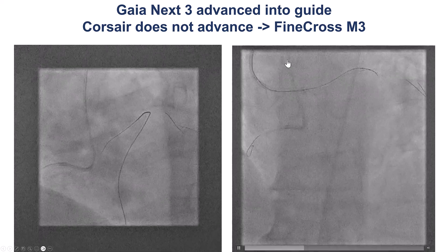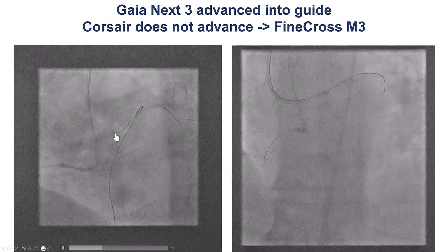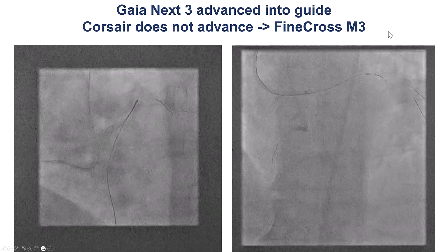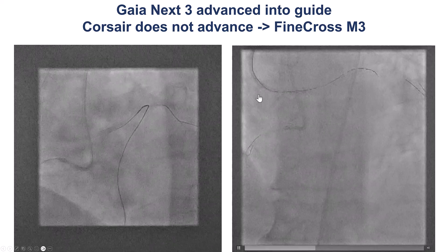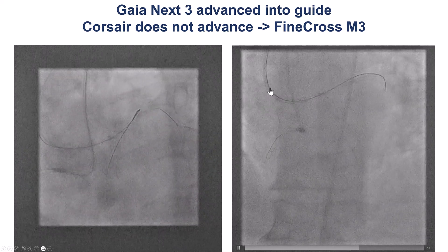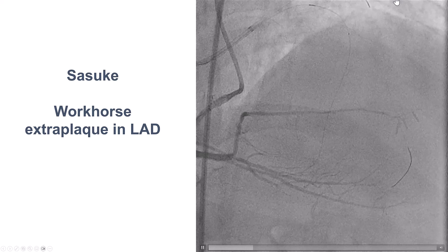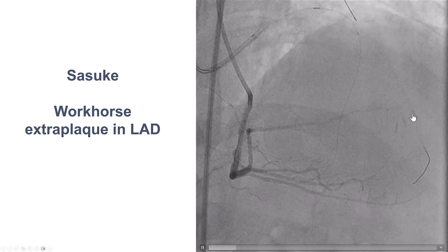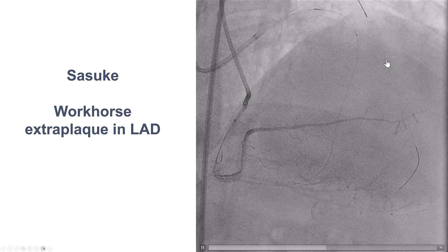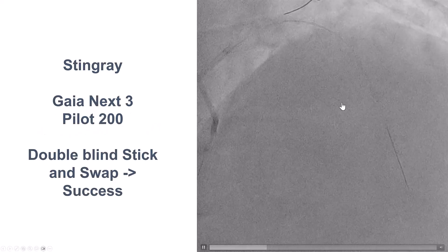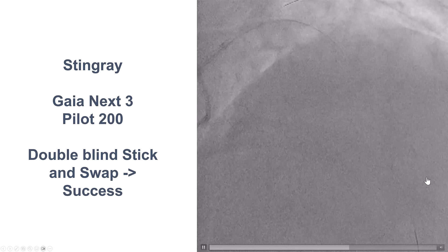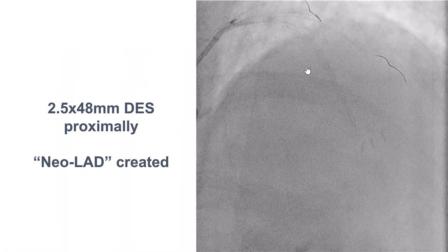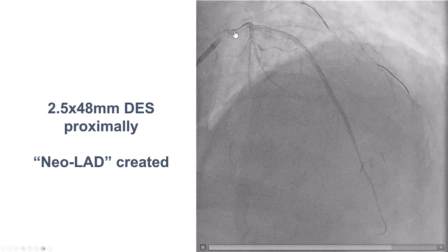We had similar difficulties advancing a microcatheter all the way into the antegrade guide catheter, but eventually we were able to advance a Finecross M3 low-profile microcatheter all the way into the antegrade guide, and then we externalized an R350 wire. We then used a Sasuke dual-lumen microcatheter to try to wire into the LAD, but the wire seemed to be into the extra-plaque space, requiring re-entry. We used the Stingray system with a double blind-stick-and-swap technique, and that advanced in the right location. We pre-dilated and stented with two drug-eluting stents, providing a nice result.